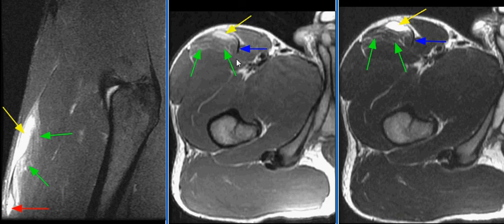The normal deep tendon of the indirect head is seen on this image, indicated by the blue arrow. MR findings are consistent with a direct head rectus femoris tendon injury.